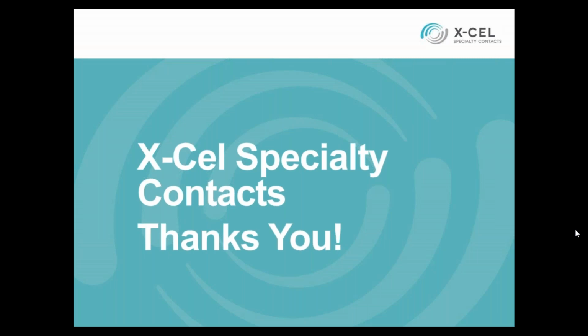Would you use Simplus to rub and clear care to soak overnight? This is a question. Would you use Simplus to rub and clear care to soak overnight, or Simplus alone? So I always leave that option up to you. Obviously, clear care is going to be your better option for that, for the overnight soaking. Simplus is simply a conditioning solution and all-in-one, and I don't feel like they are as good at cleaning as a clear care would be. So I hope that answers your question.